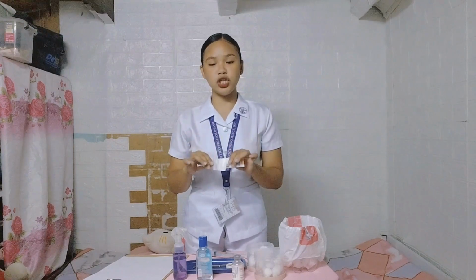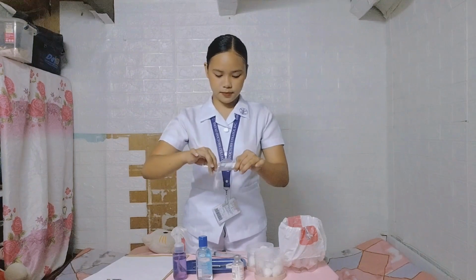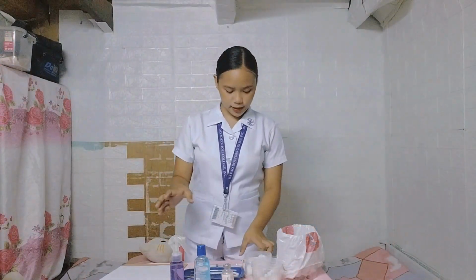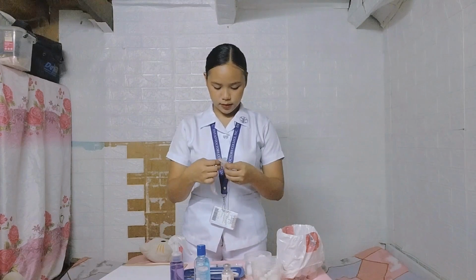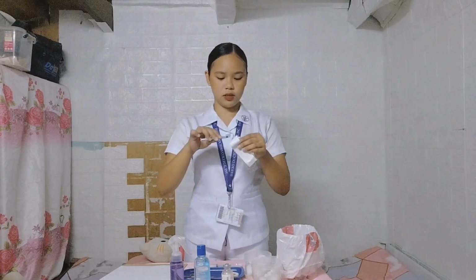Now open the aspirating needle, then connect the barrel to the aspirating needle, ensuring that the needle is firmly attached to the syringe.